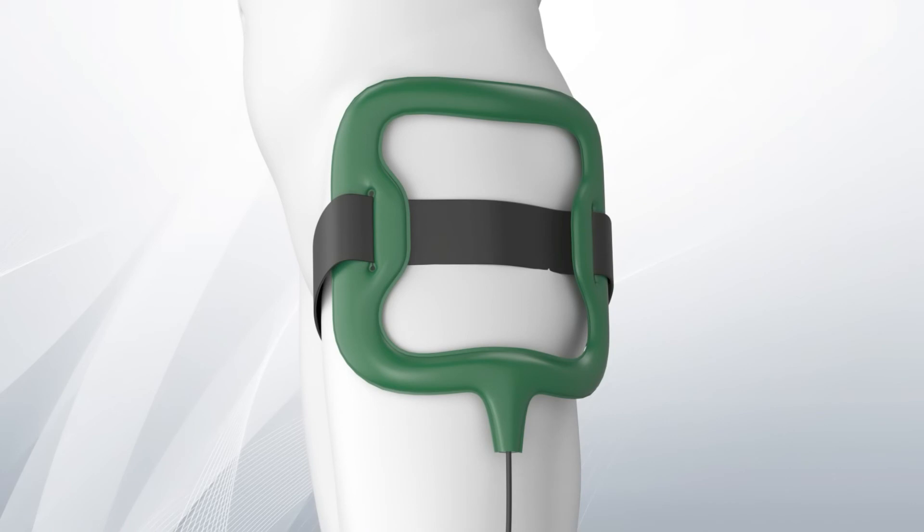Depending on the area to be treated and your condition, we will advise whether you need to use one or two coils.